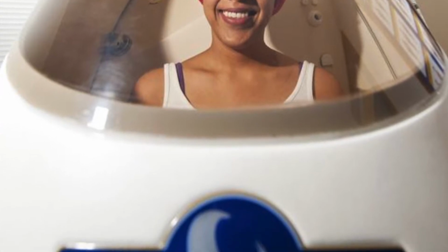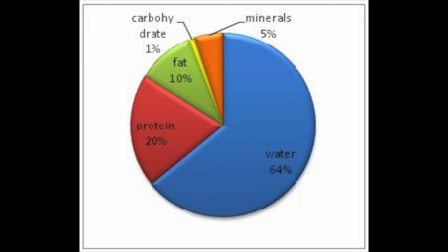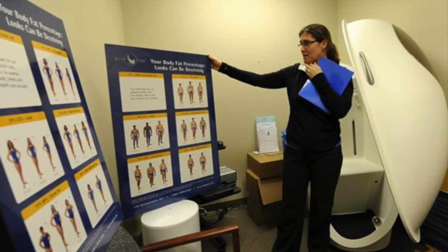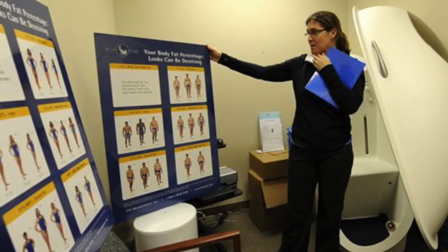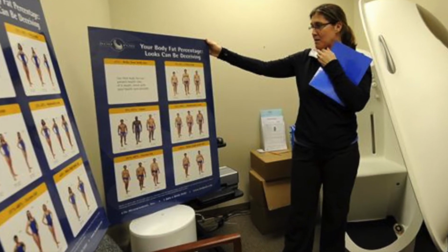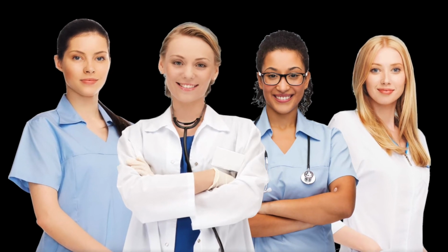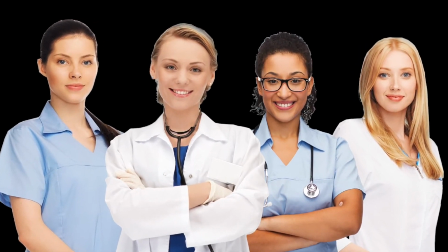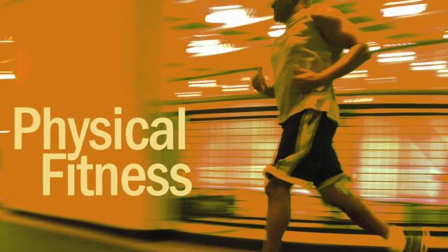Air displacement plethysmography is a technique used to determine human body composition. Developed into a viable system in the mid-1990s, plethysmography refers to the measurement of size and, in this case, volume. It is a tool used by doctors, nurses, nutritionists, and athletic trainers to help patients assess their overall health and efficacy of their exercise programs.